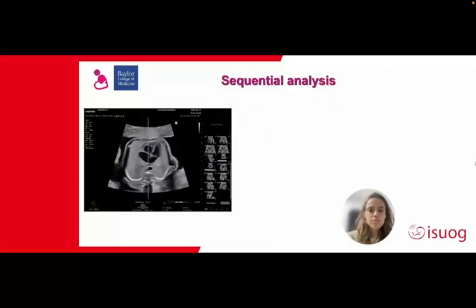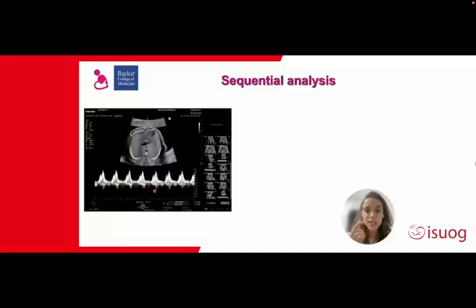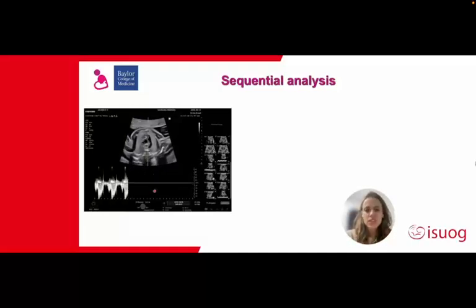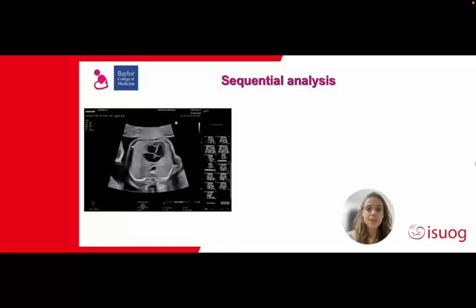And just to conclude with some other tools that are available or will become more and more available when we do cardiac function assessment. We tend to do indexes, the Tei index, the MPI index, and basically they are easy to obtain, but they are tedious, they are laborious. We need to take a measurement here, take another there, and then do all the measurements and all the calculations.